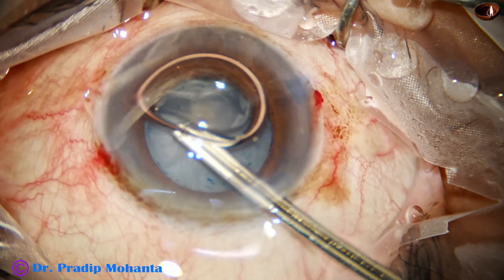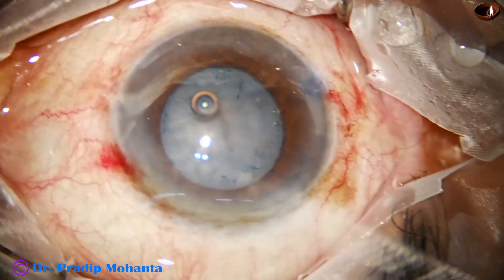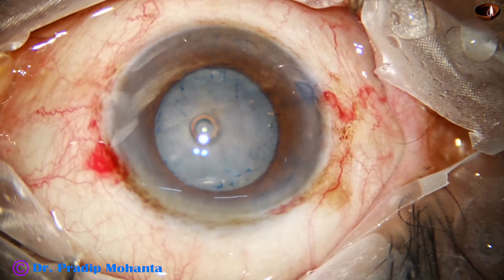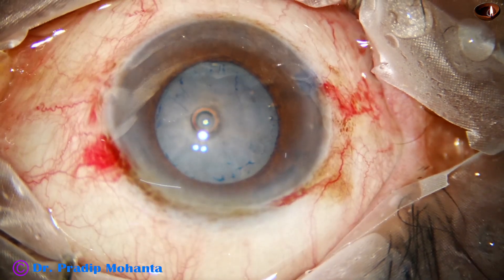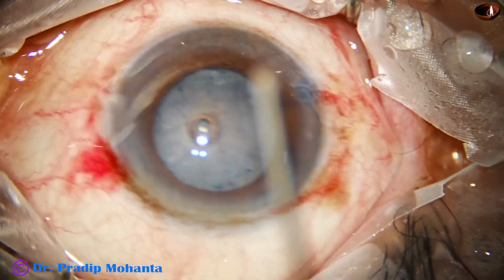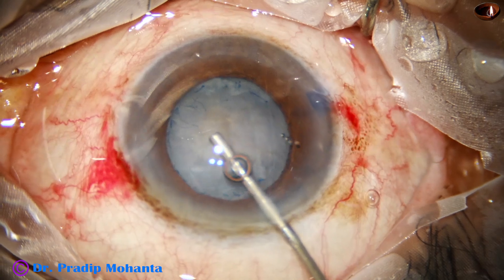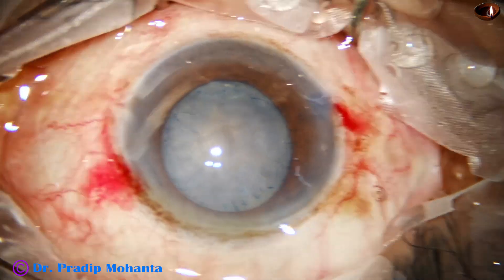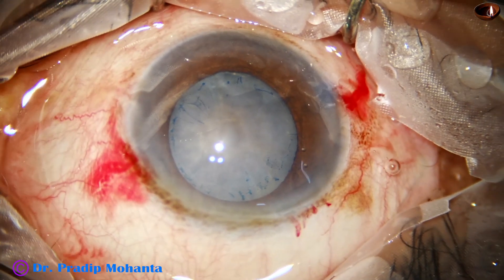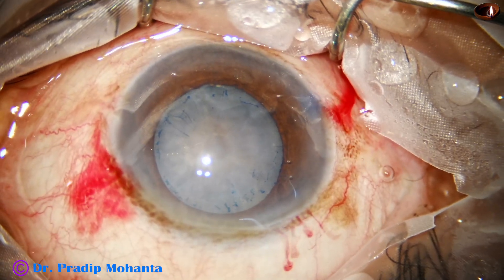Excess dye is then washed out with a 23G Simcoe, and in this case we can clearly see the anterior insertion of zonule. The anterior chamber is filled up with 2% hydroxypropyl methylcellulose. We can see that the zonule has been stained by the trypan blue dye — more densely and more intensely than the capsule.